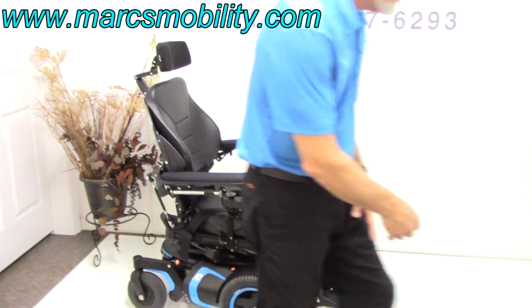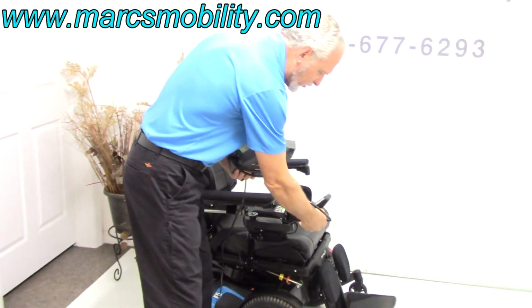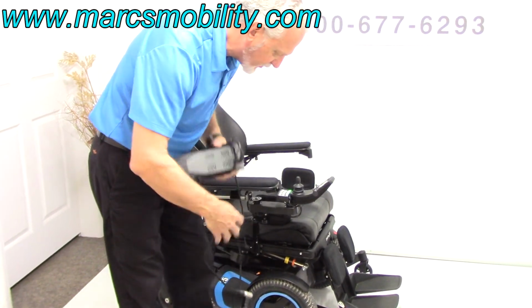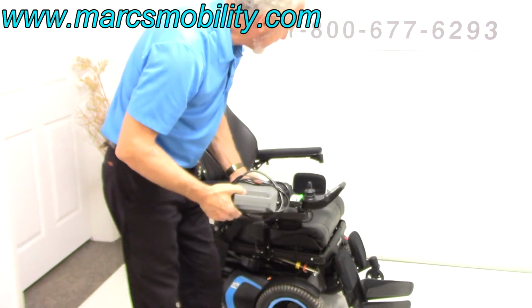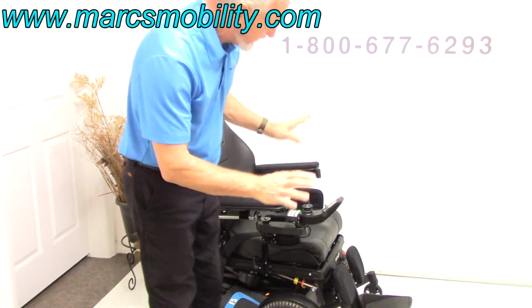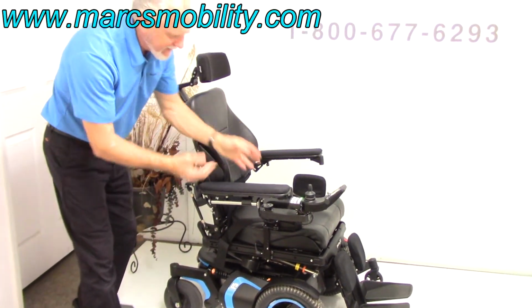This chair, when you charge it, take your Permobil charger, plug it in the bottom of your joystick. As soon as the light turns green, from orange to green, you're fully charged. These chargers will turn off automatically when the batteries are full. There's 2 batteries on all power chairs. There's 2 in this one also. They come out from the back, right here. The seat would have to be elevated.